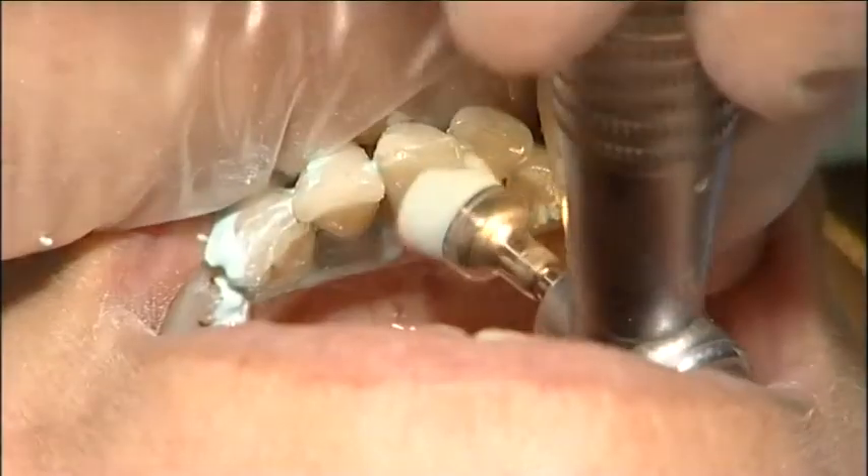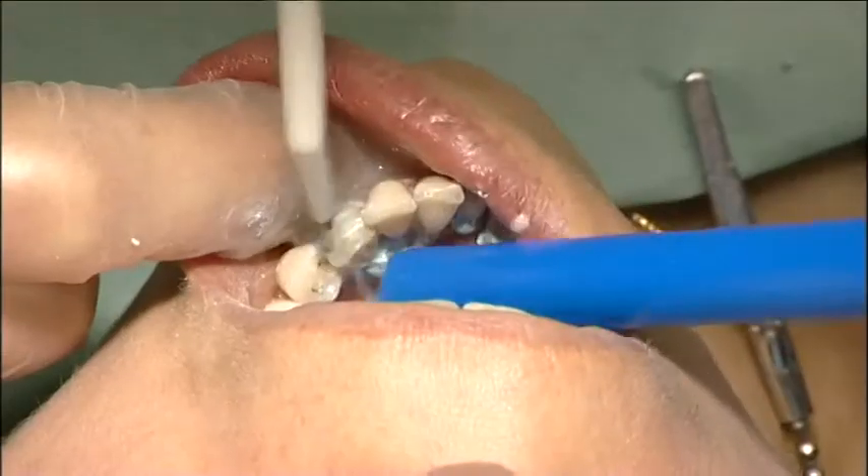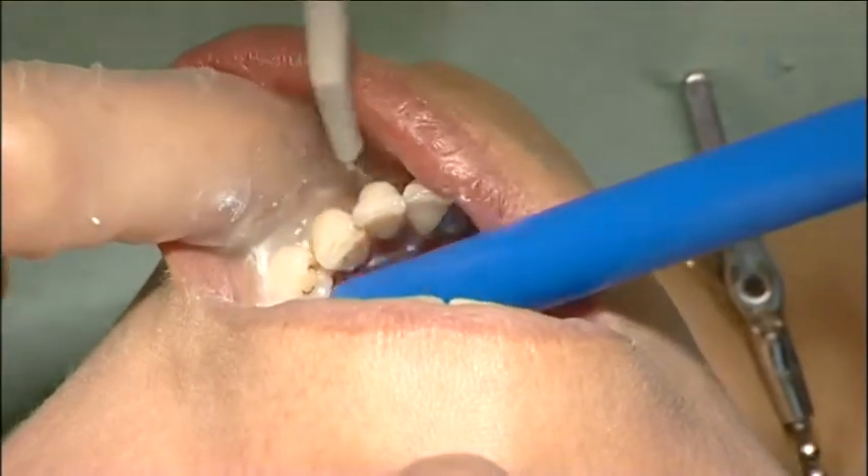The teeth were cleaned with pumice and water, and then rinsed and air-dried carefully.